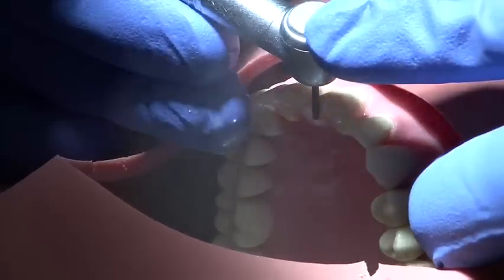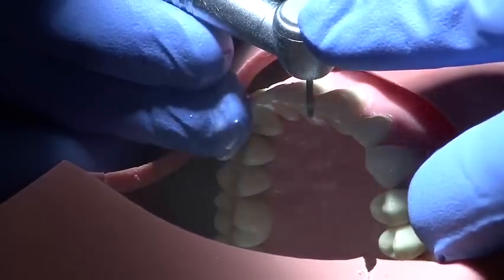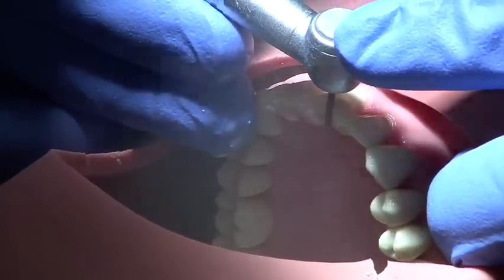A small portion of tissue can be retained mesially and distally to prevent damage to the adjacent teeth.